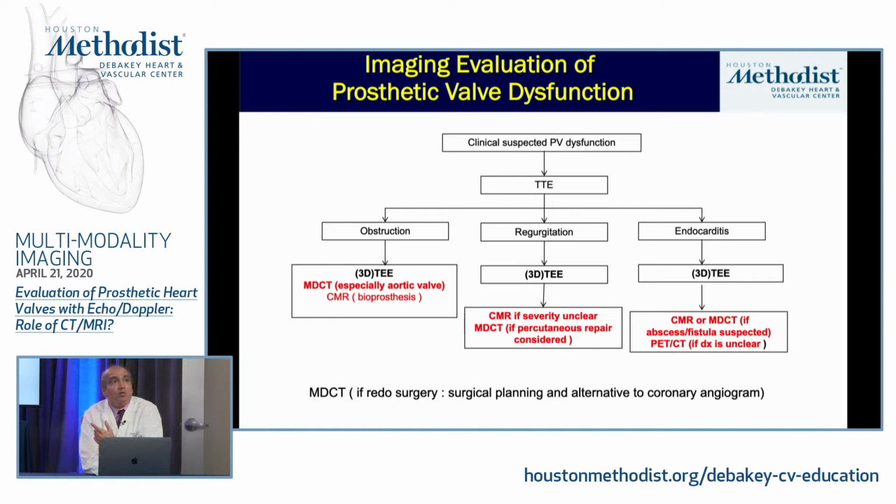And so, why don't we go ahead and wrap up and let's take time for questions. Why don't we have a discussion here and answer the questions that are sent. Question to you, Dipan and Sumin. One, do we agree that any evaluation of prosthetic valves has to start with a Doppler echocardiogram? Yeah. Truly.